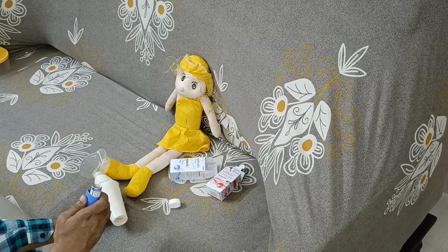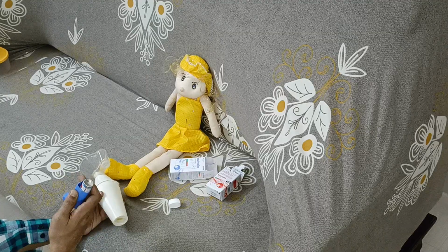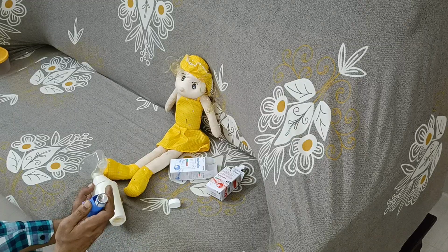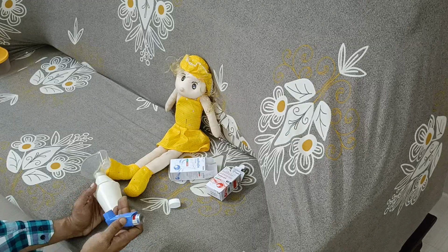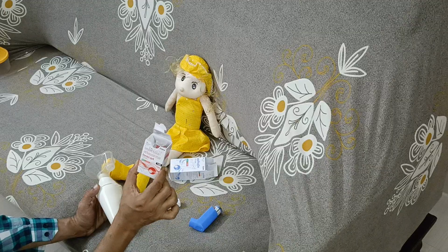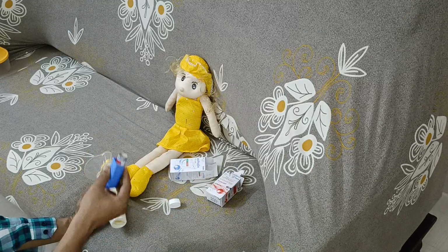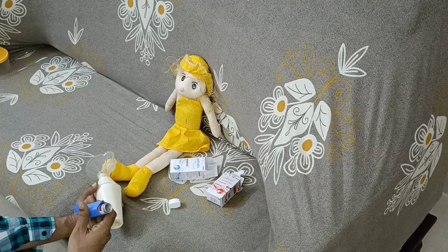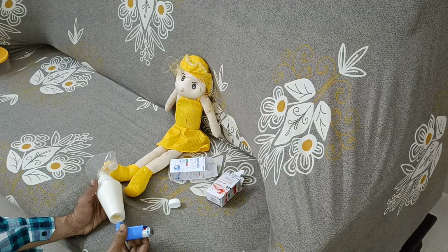If the patient is going for a second puff, you have to wait at least 20 seconds. And if the patient is going for a second medicine, for example another steroid or another medicine, you have to wait at least 2 minutes in between. So these are the points you have to keep in consideration.